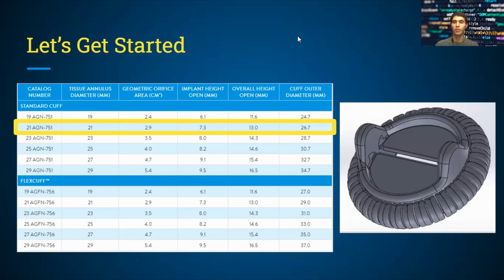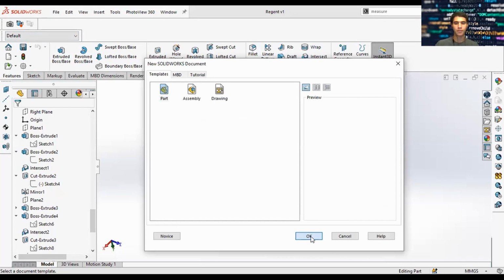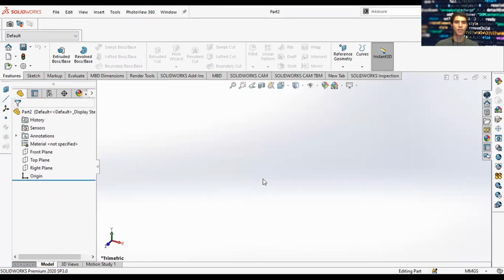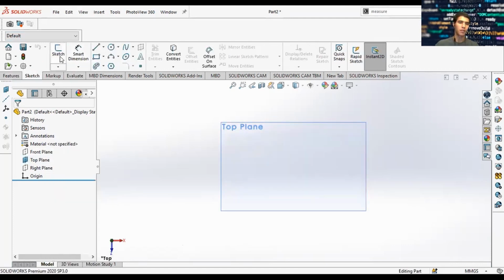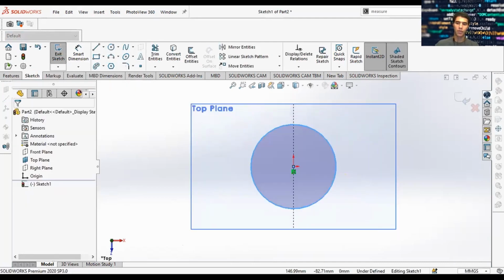So let's get started. This is information on specs that's available online publicly. Let's go ahead and switch over to SolidWorks at this point. So this is how it looks. The first thing we're going to do is make a new part. File, new part. Okay, so now we're on a new part, and we're basically starting from scratch. This is an orientation of the top, front, and right planes. We're going to get started on the top. We're going to show our top plane so we can sketch on it. Just to give some dimensions, we are using MMGS, millimeter gram second, so that's our unit system. It's good to know that we're using MMGS.